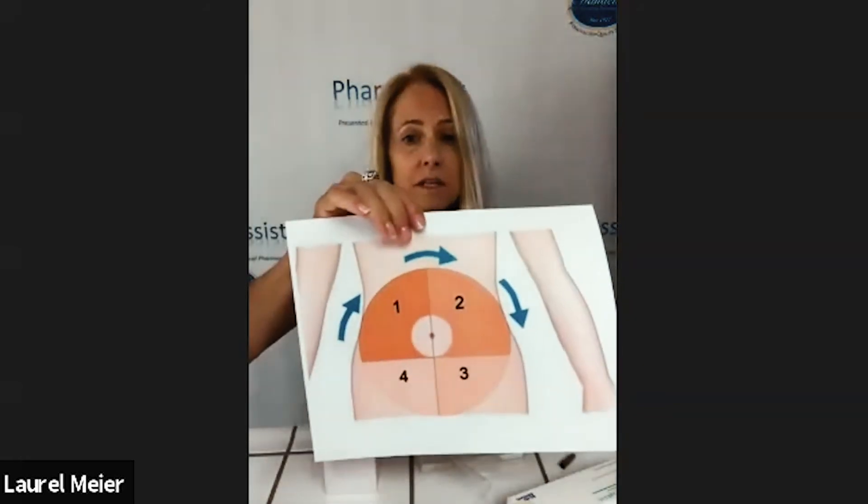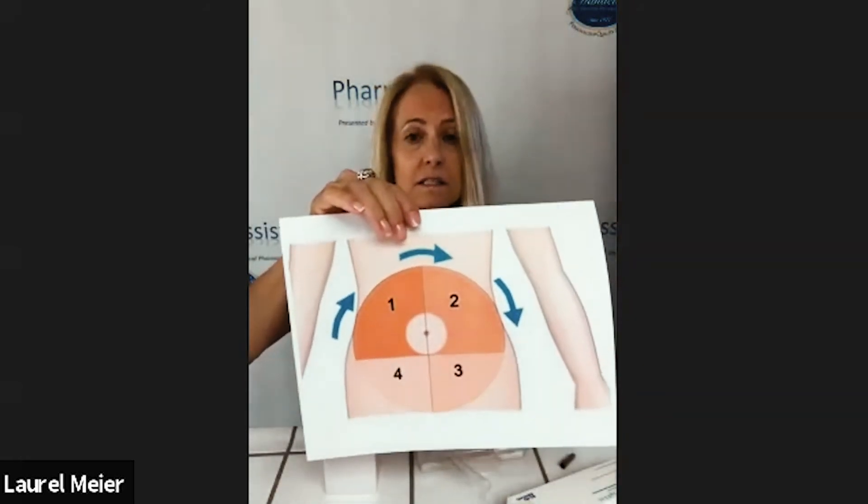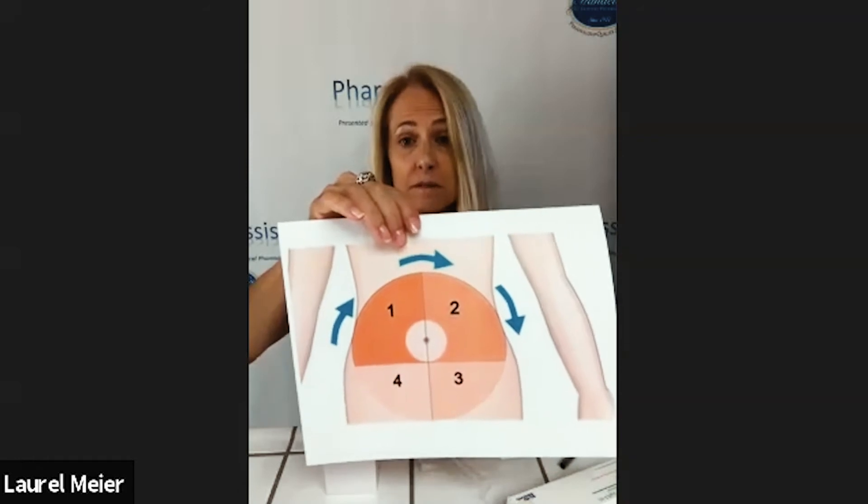Now to give the shot, you want to pick a spot in your abdomen. You can pick any spot you'd like as long as it's at least an inch away from the belly button and there's some fatty tissue to squeeze.